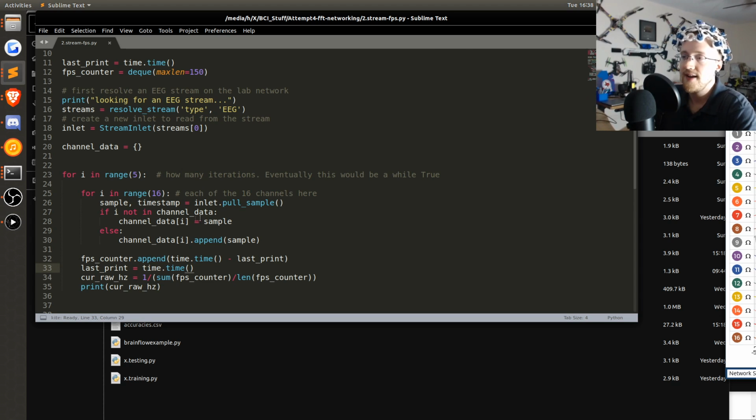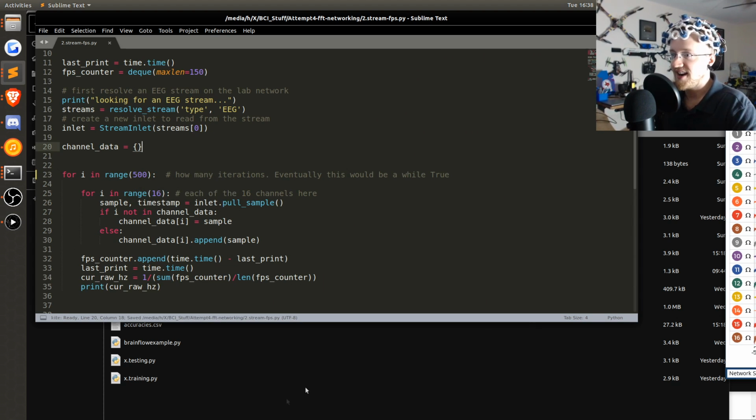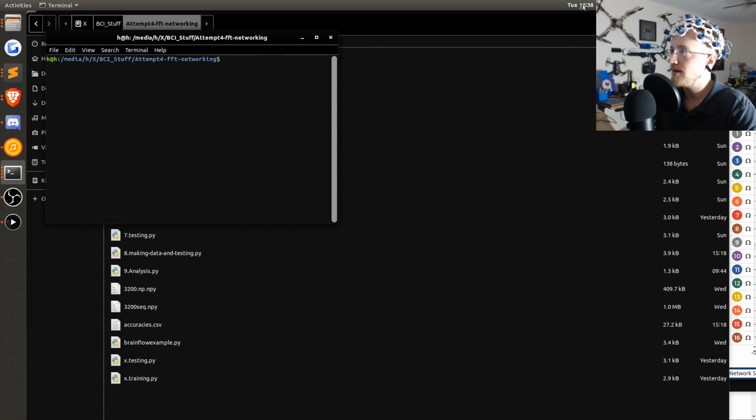So you connect to that, and then again, it's going to come in chunks of 125, and as we already saw in the docs, it's 125 data points per channel. We have 16 channels, so we're going to get 16 channels of 125 data points, and we're just going to keep cycling through that. So one thing I could do is rather than say 5, we could do this, I don't know, for 500, or we'll do 5,000.